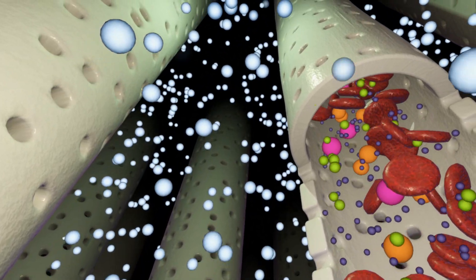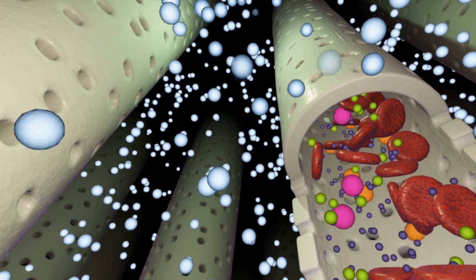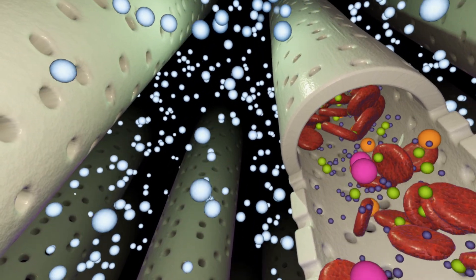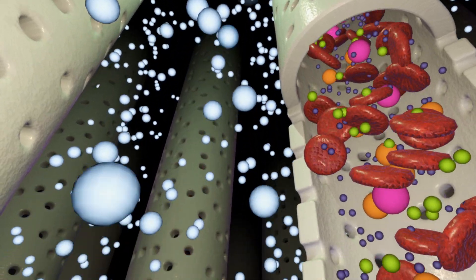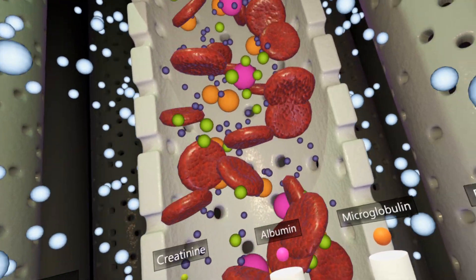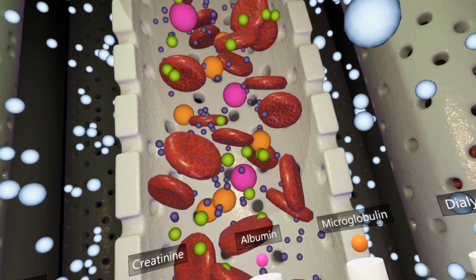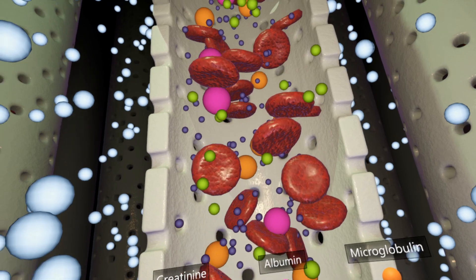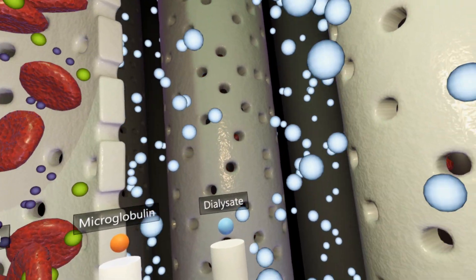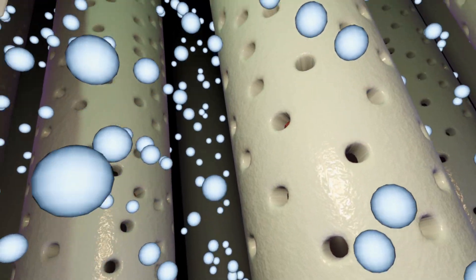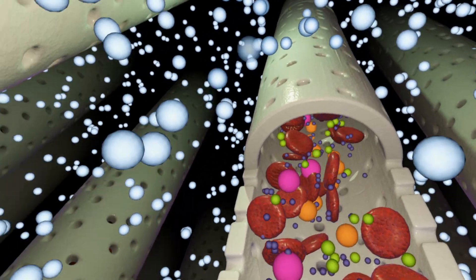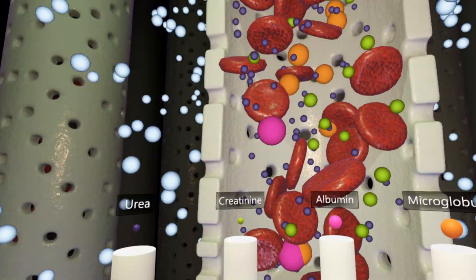Dialysis solution, or dialysate, is a liquid drug that's adjusted to the individual patient's needs and distributed to a dialyzer. Its purpose is to take out excessive solutes from the bloodstream that were not removed by the kidneys.